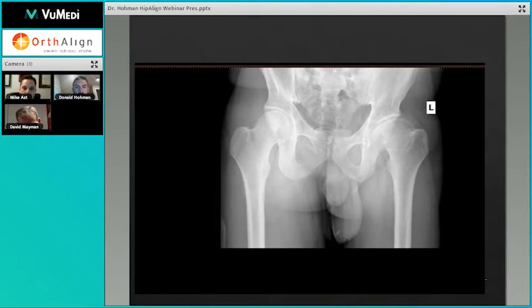And again, this is just another example of one of those kind of hips where there were really no identifiable landmarks inside that socket. The other thing with these patients that I've always found to be a little bit challenging is that they have these severe shortening deformities, which makes restoration of leg length a little bit challenging. So the additional information that you get from leg length in real time is also really very helpful.